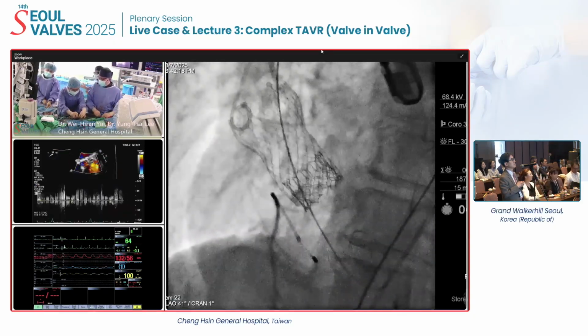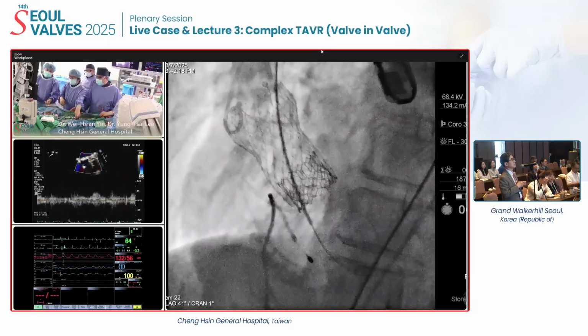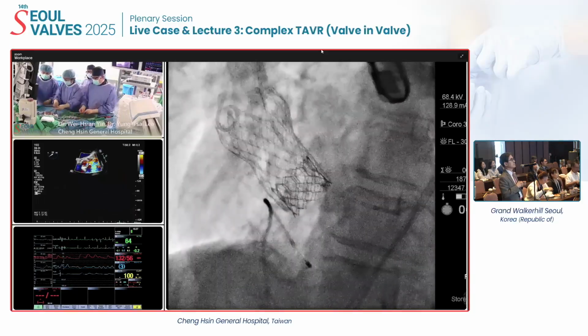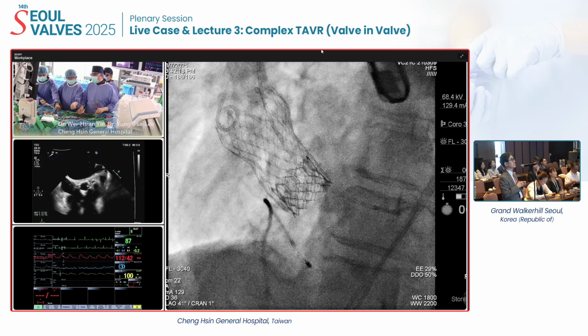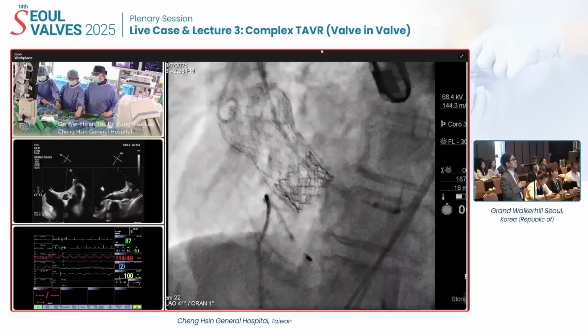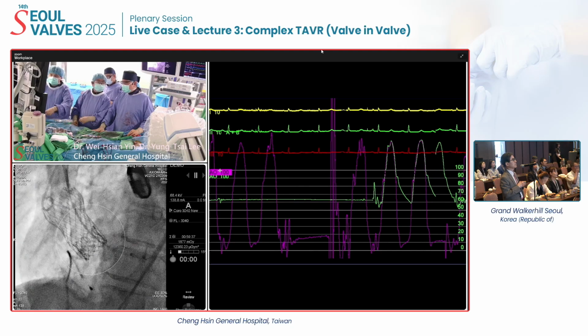So you have to have the transcatheter valve prepared in advance, at the bottom of the table, with everything ready, and then you do the large balloon dilatation and put in the valve. With BASILICA, you make the final laceration after you have already prepared everything.